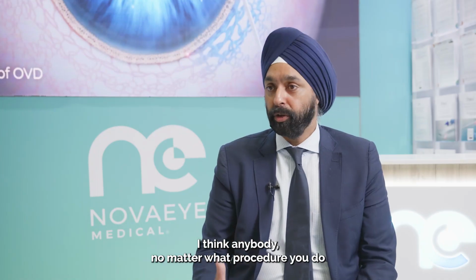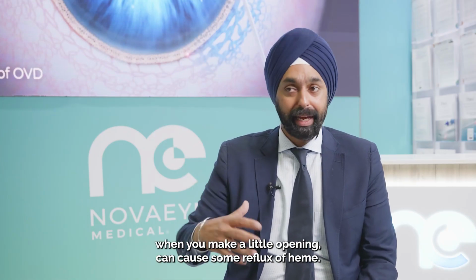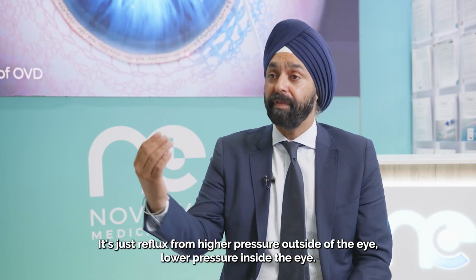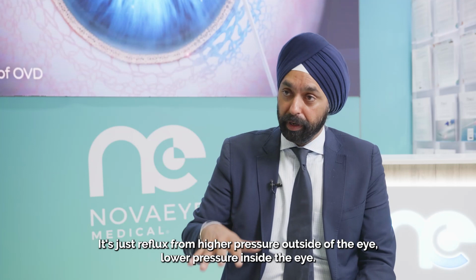I think anybody, no matter what procedure you do, when you make a little opening, can cause some reflux of heme. And I always tell patients, doctors, it's not bleeding. It's just reflux from higher pressure outside the eye, lower pressure inside the eye.